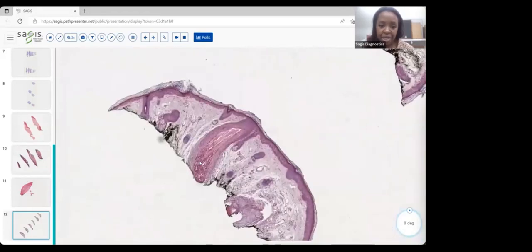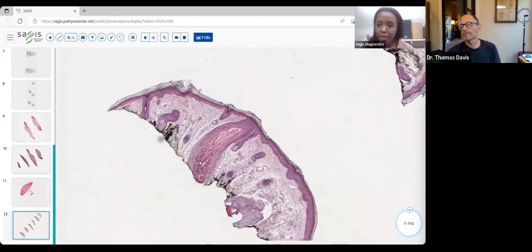So that's it for today. We've had a good opportunity to review viral infections, to talk about the various different types of viral cytopathic effect in a way that is diagnostically useful. And again, that's most of the point, that we can really use this information, these histologic findings that we are learning and seeing to differentiate between sometimes very similar diagnoses.